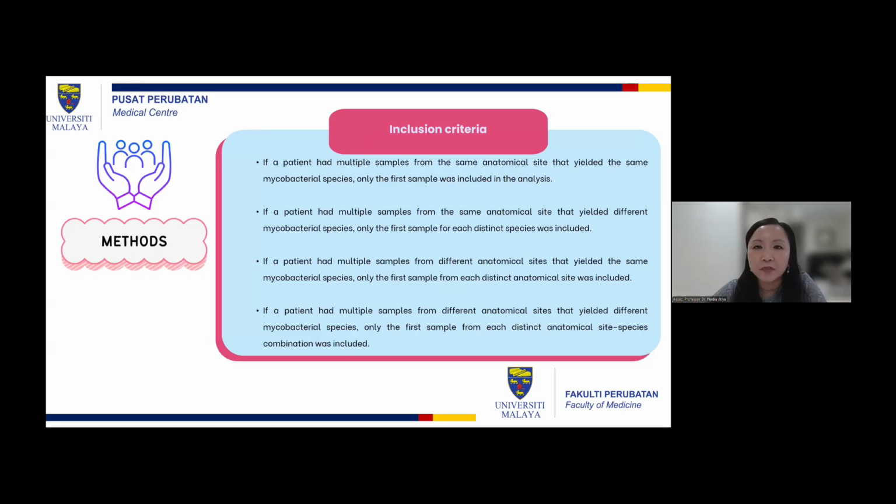We excluded samples from adult patients that yielded mixed NTM/MTBC in mycobacterial culture. We also excluded mycobacterial cultures that were contaminated with bacteria, as well as samples from the pediatric population.